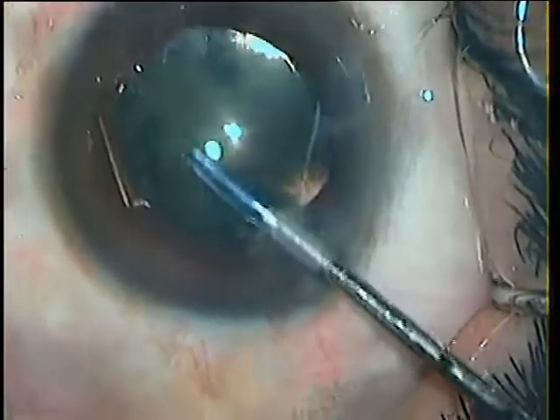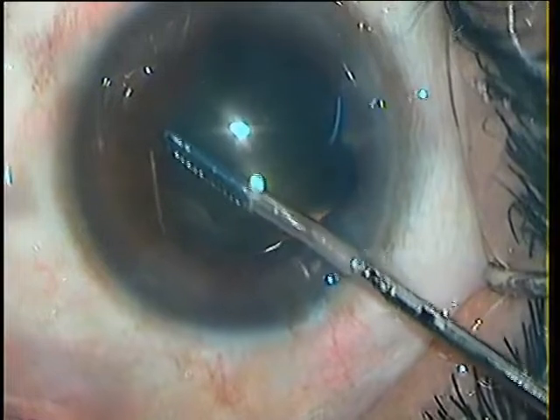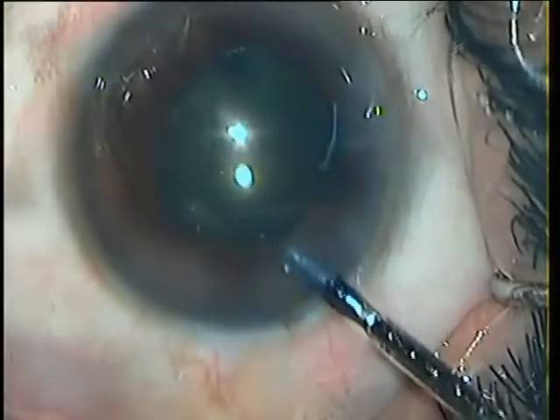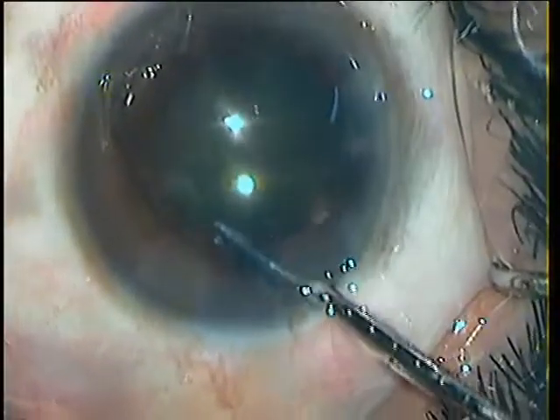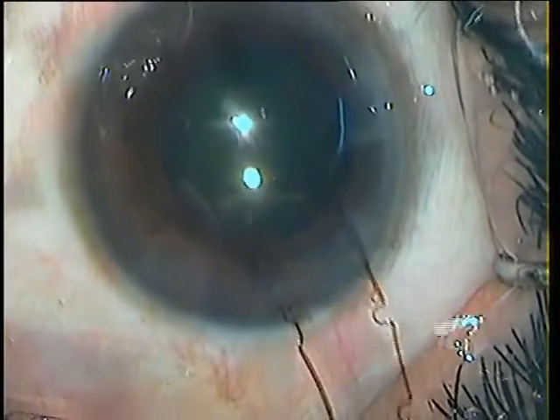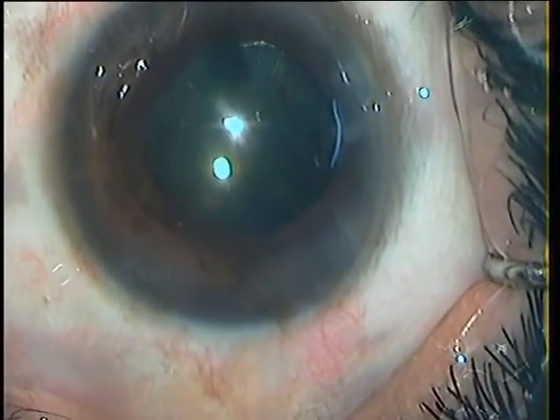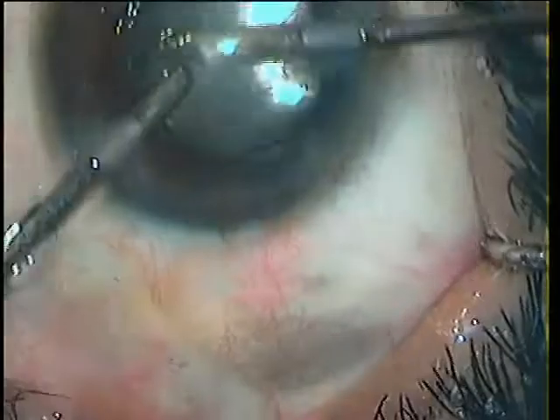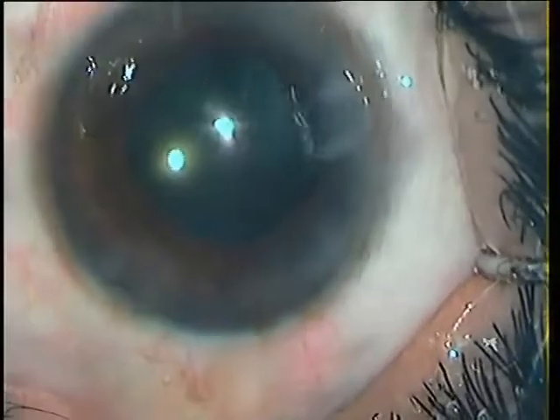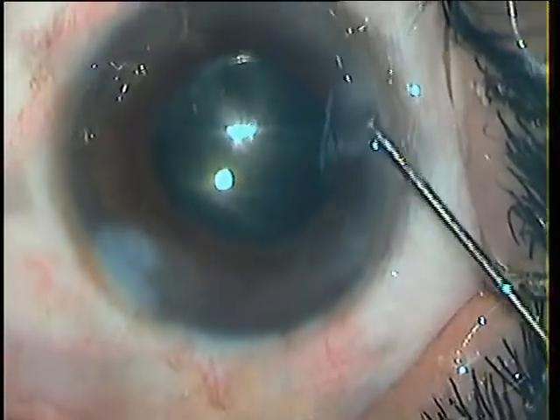Now for the removal of the ring. Hold the ring and dislodge it from under the iris first, to bring it completely into the AC. And once in the AC, just pull it out. The anterior chamber is washed of the visco and the wounds are hydrated.